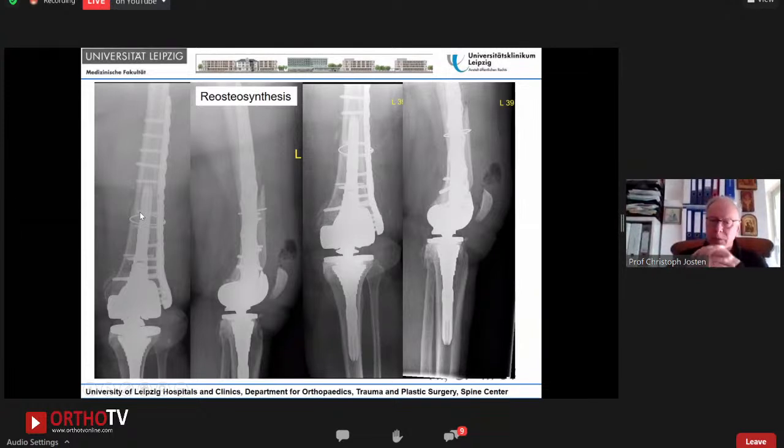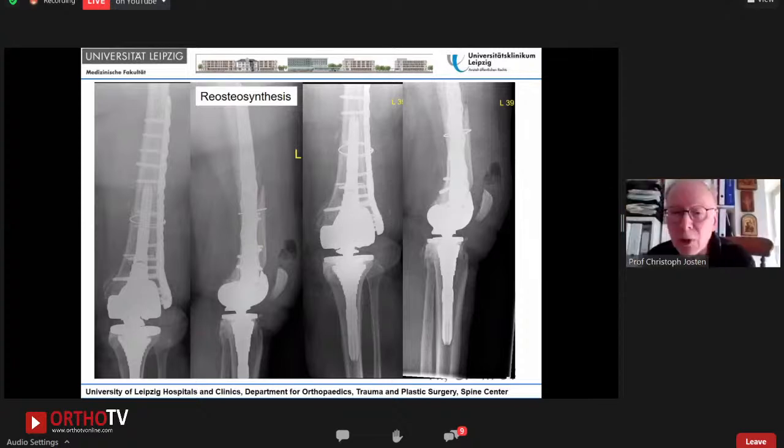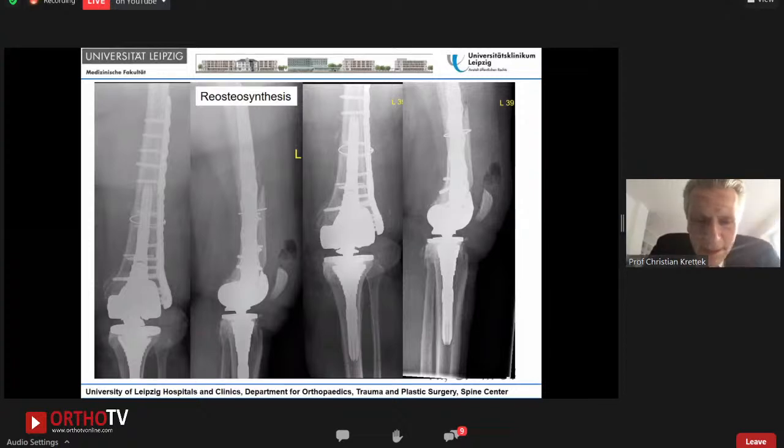Yes. Rajiv, your opinion, would we get a good result or what would you do? This is doubtful, sir. Looks good on the X-ray, but doubtful as the result. Christian, what is your opinion? Yeah, as I mentioned before, locking screws are good for shear, but bad for pullout. And this case has nicely demonstrated it.